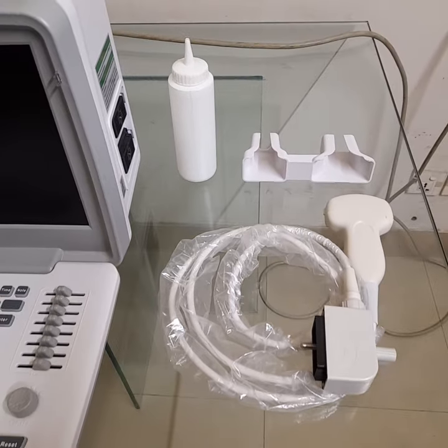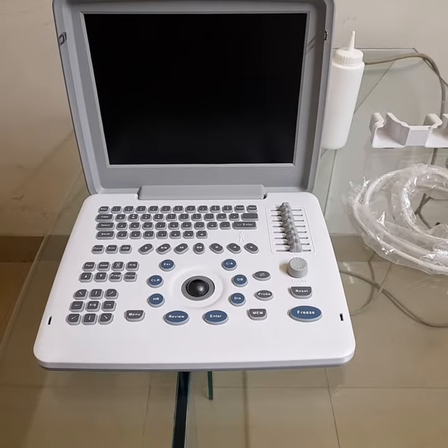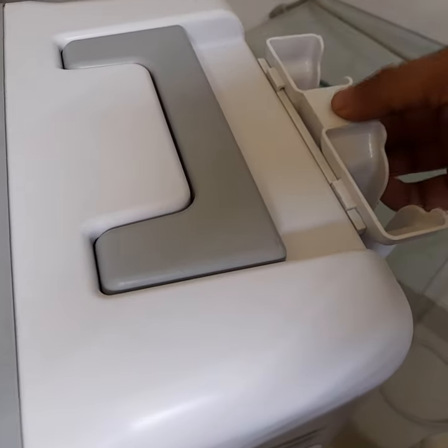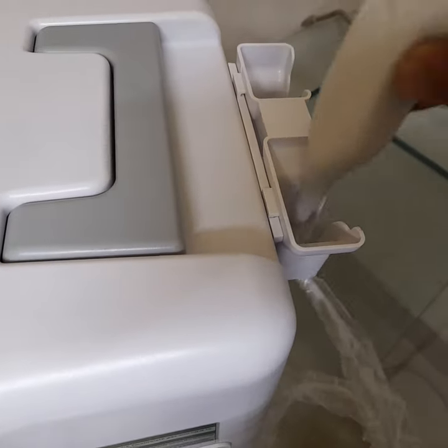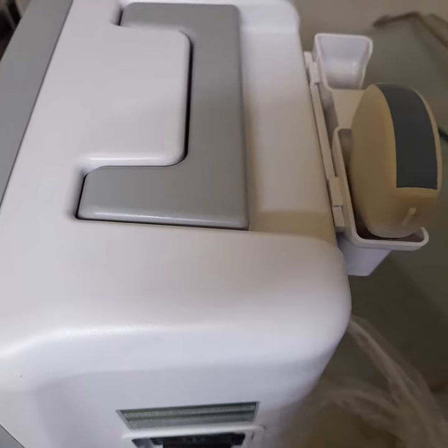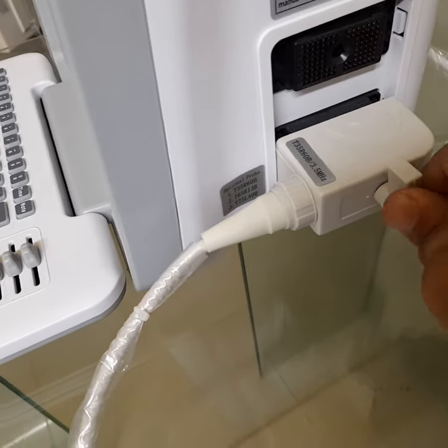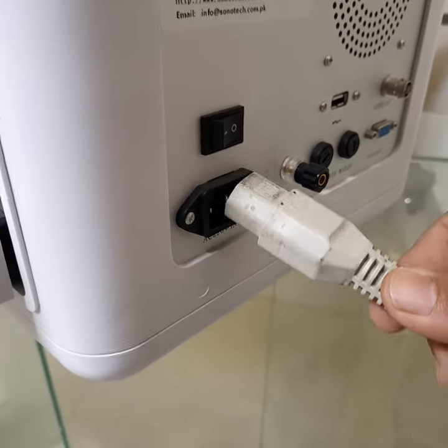Probe Holder, Gel, Convex Probe. Probe Holder. Convex Probe. Probe Connector. Power Cable.